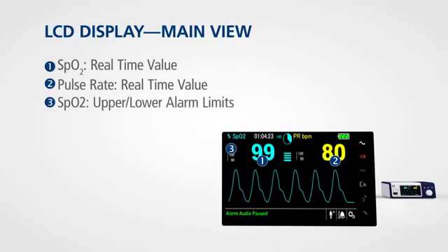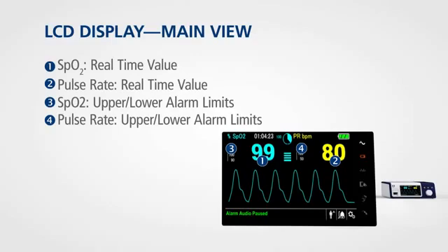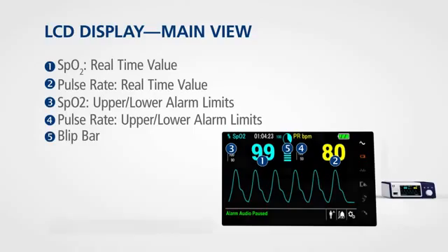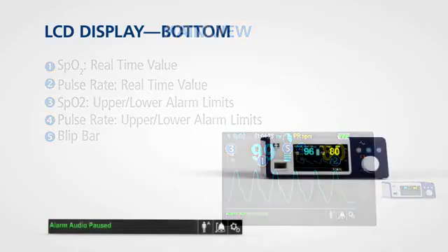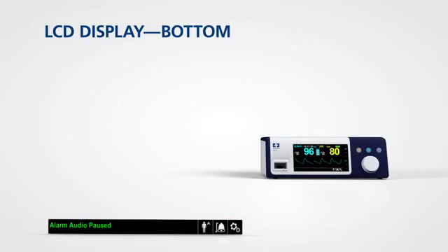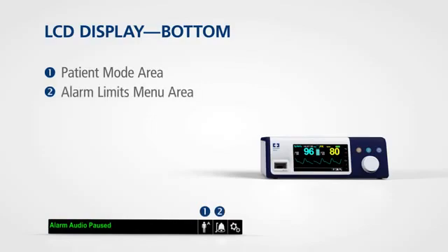The main view also shows upper and lower alarm limits for SPO2 and pulse rate, and includes a blip bar display that indicates pulse beat and relative pulse amplitude. A bar along the bottom of the display provides informative messages and indicators for the patient mode area, the alarm limits menu, and the options menu.